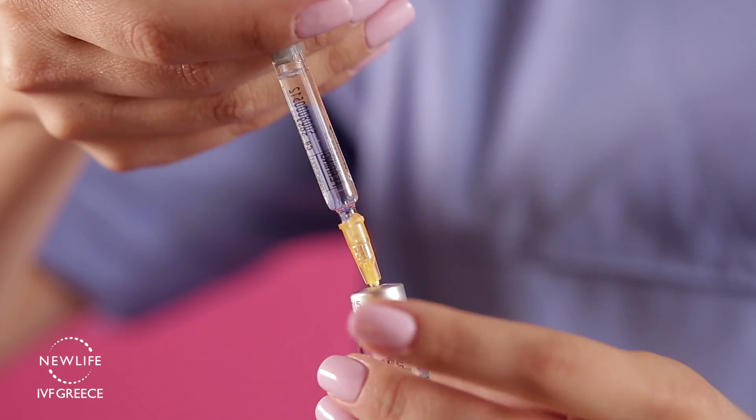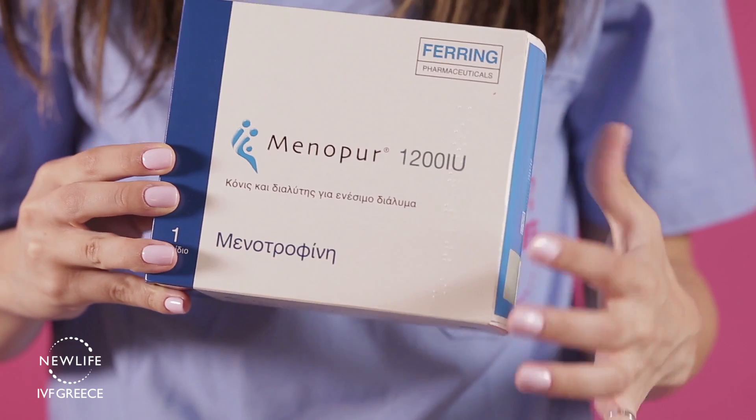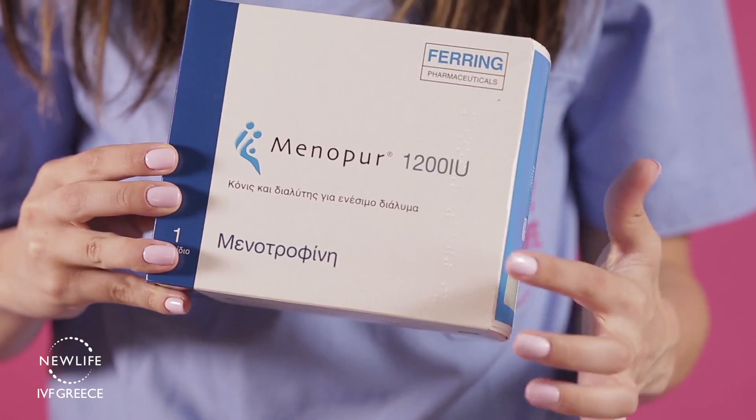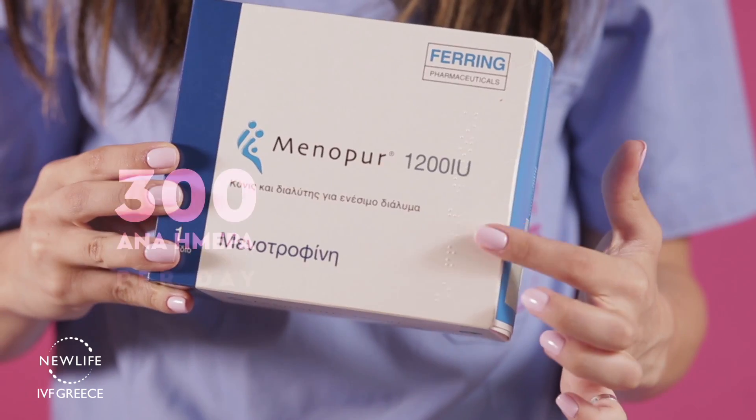In your vial of Menopur you now have 1200 units, and you should perform daily the dose in your instructions. If, for example, your dose is 300 units daily, that means one Menopur box should last you for 4 doses, 4 days.